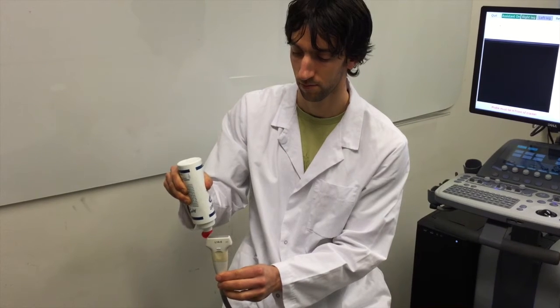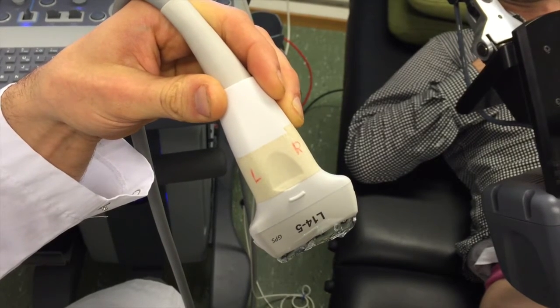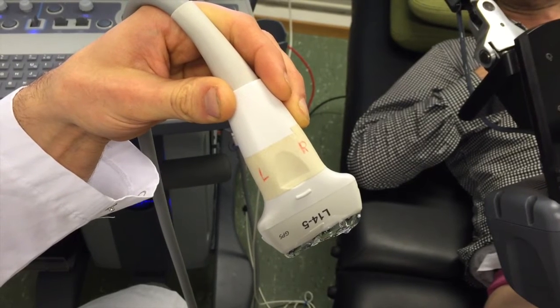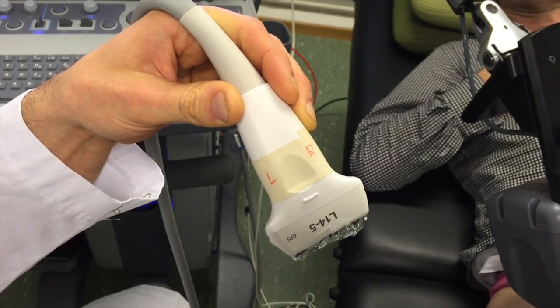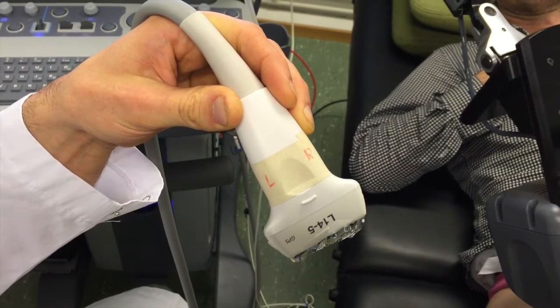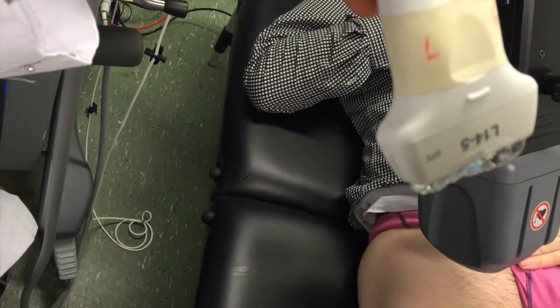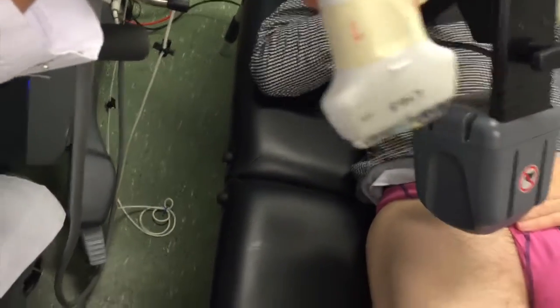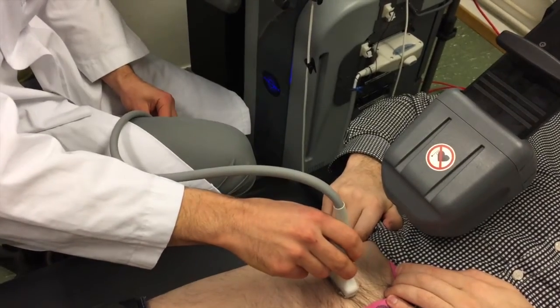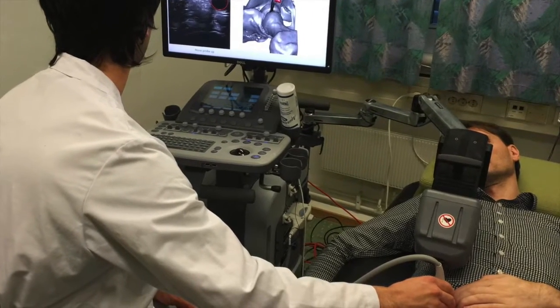First, put gel on the probe. The ultrasound probe should be placed on the patient so that the L on the probe points to the left side of the patient, and the R points to the right side of the patient. Then place the probe on the patient in front of the tracker. When scanning has started, neither the tracker nor the probe should be moved.